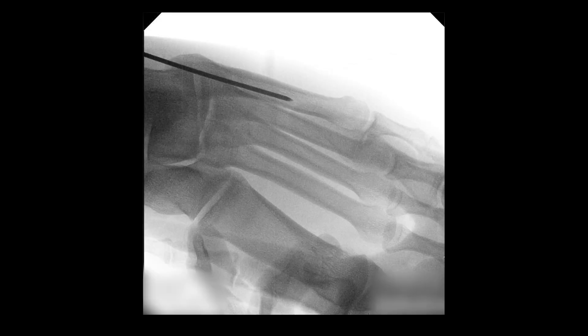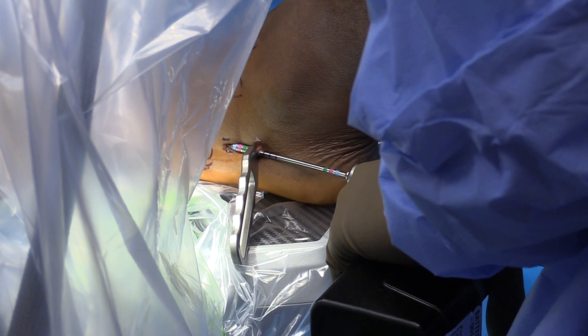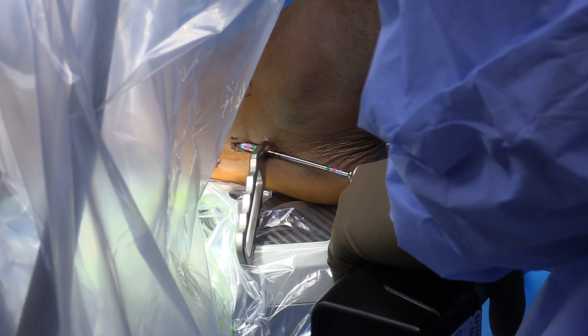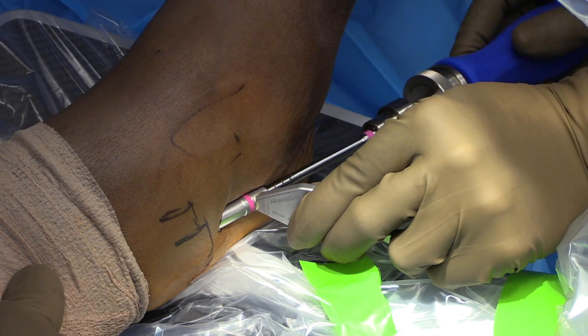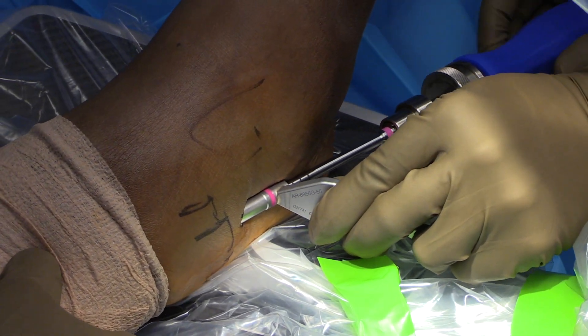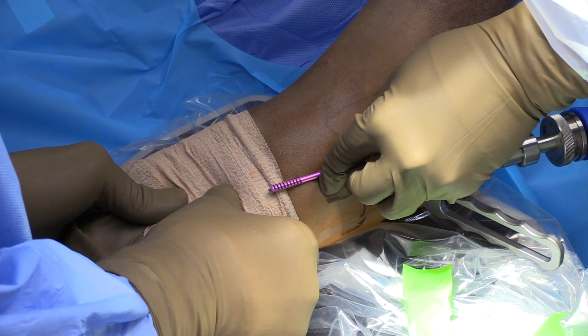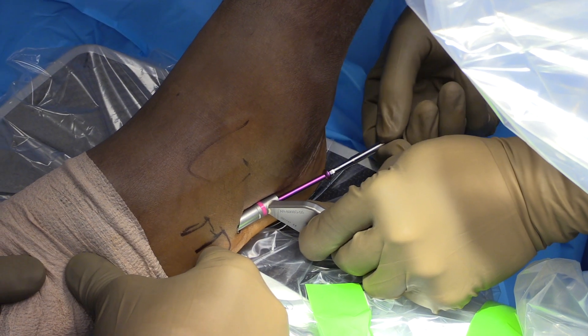Lateral imaging confirms appropriate placement and reaming over the guide wire is performed with sleeve protection. Imaging intensification confirms the appropriate position. The tap is used to determine the correctly sized screw — we wait for appropriate chatter. The screw length is measured off of the K-wire. We also place a screw adjacent to the 5th metatarsal under image intensification to make sure it is not too long.